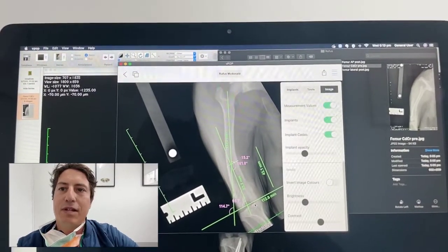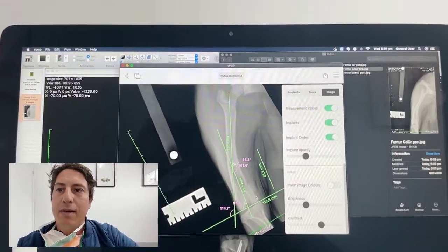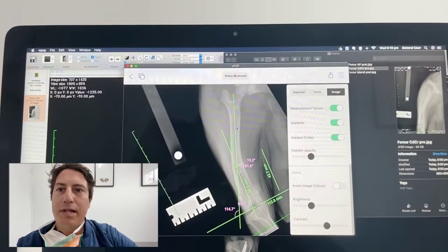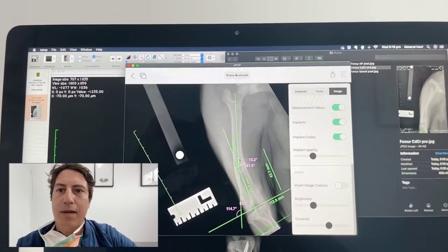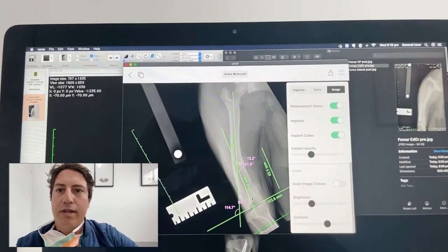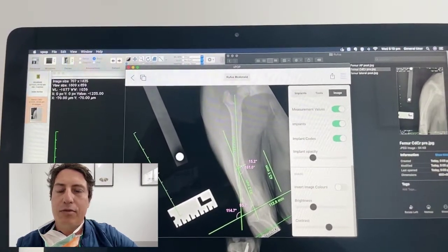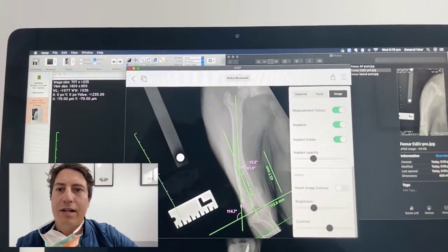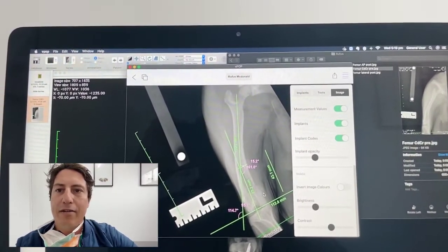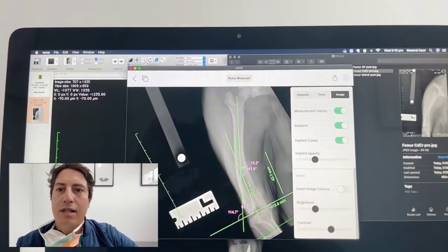So the first thing to remember is when we're looking at these medial patella luxation cases, you want to assess the alignment, particularly between the quadriceps apparatus, the trochlear groove here, and then the attachment point of the patella tendon on the tibial crest down here. You can see this patella sitting all the way out here, and as I said, this is a grade four luxation.